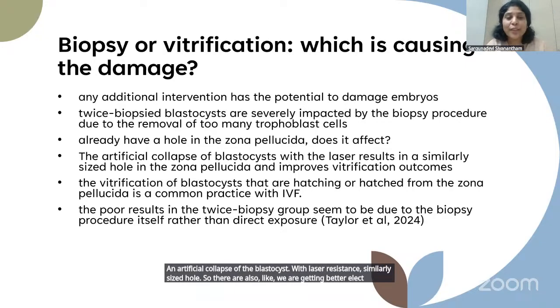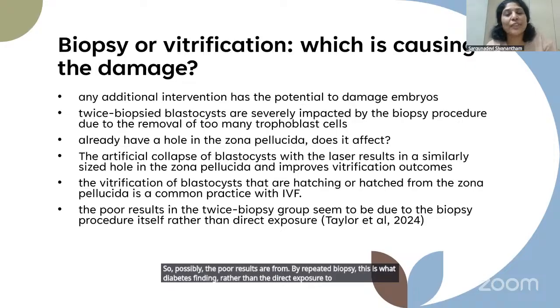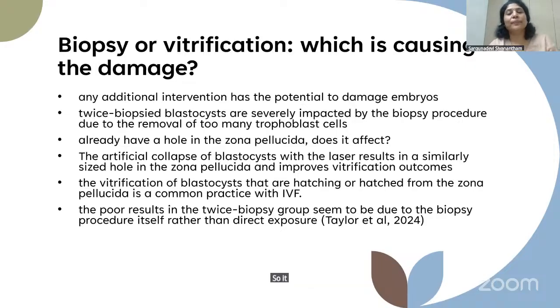vitrification outcomes. So possibly the poor results are from repeated biopsy. This is what they've been finding, rather than the direct exposure to the cryoprotectant with the hole. So it could be the biopsy, not the revitrification. Probably it's having a minimal negative effect.